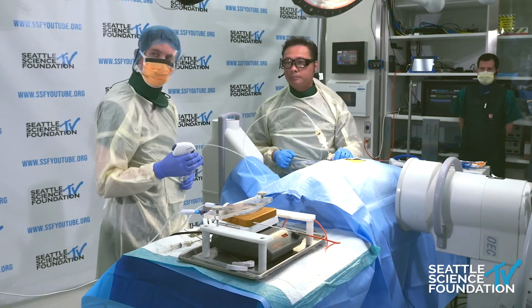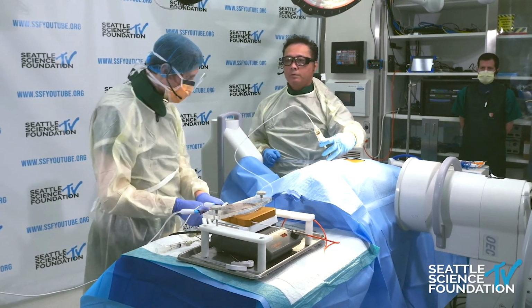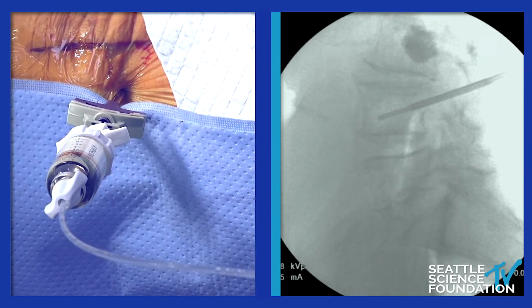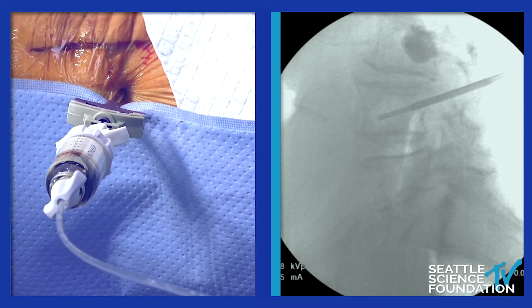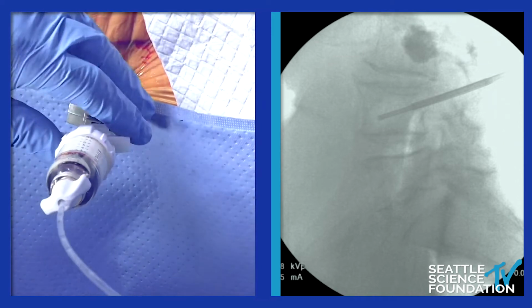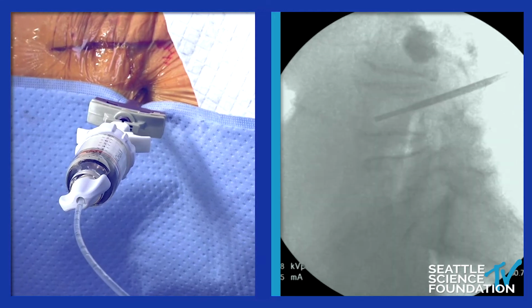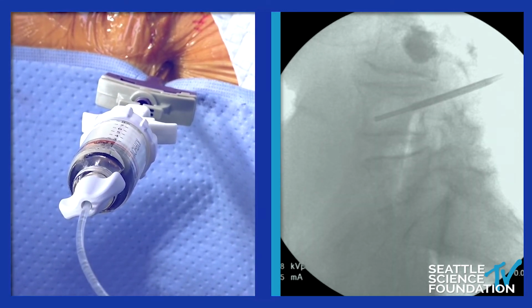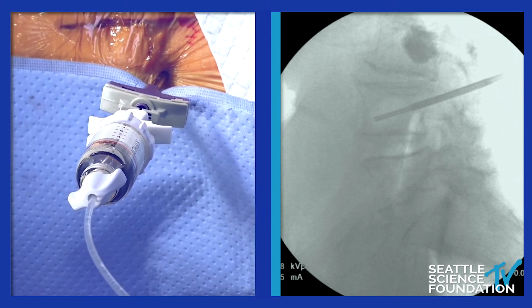Let's take a shot. I'm going to push that further in. Gotta advance that. Yeah. And you can actually see the outline of the balloon kyphoplasty balloon inflation there in the lateral view. Proceed. And go ahead. Good. So we've already had the cement sit for 8 minutes after it's mixed. Now we're delivering the cement.